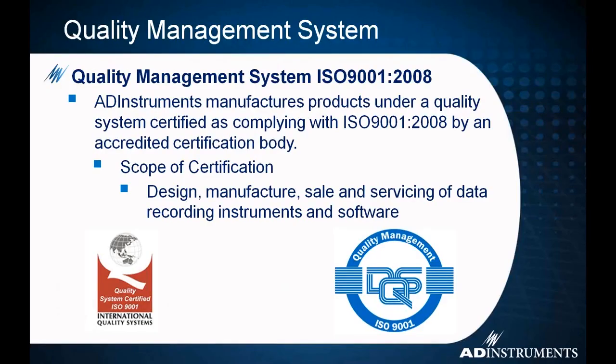I also get a question quite often: how do I know what's coming out of the Power Lab is what really is being input into it? How do I know what I see in LabChart is true? We spent a considerable time and money to get quality ISO 9001 certified. It's a quality management system. Just that they look at our manufacturing process, our validation processes, our design processes to make sure that we're meeting current standards for the production of biomedical research equipment, and that we are what we say is coming out and what is being input into the Power Lab and going through LabChart is actually what is happening.